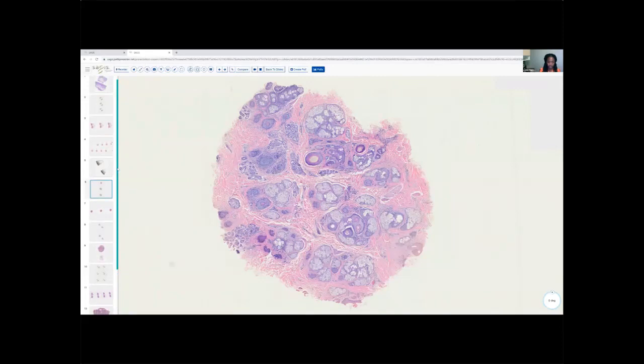We looked at psoriatic alopecia. We looked at alopecia areata. Telogen effluvium, the main feature again there is going to be that catagen-telogen shift, really without necessarily any real sense of a lot of hair or follicle unit decrease. It's just really that catagen-telogen shift.